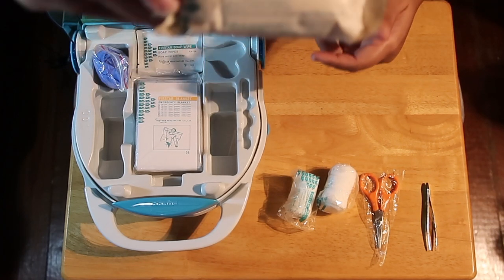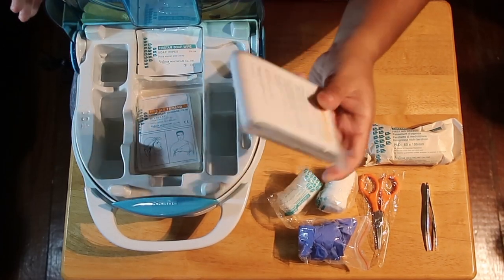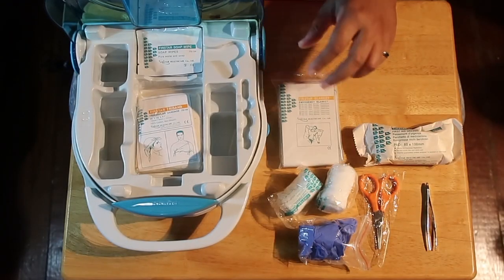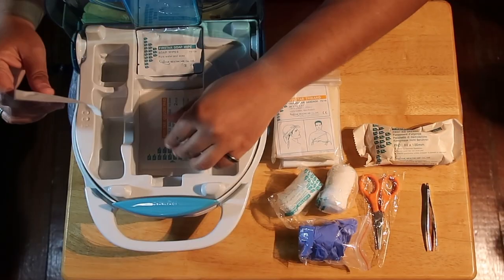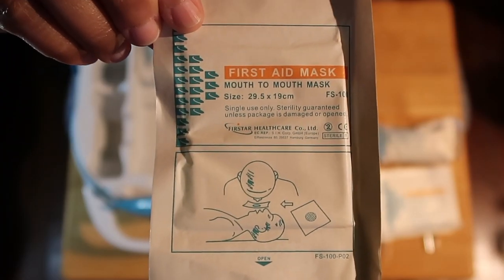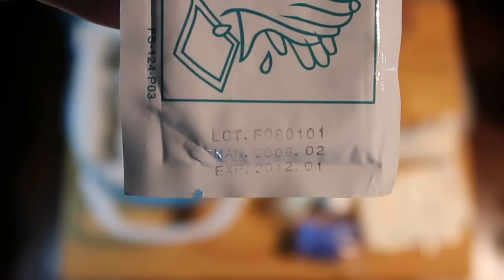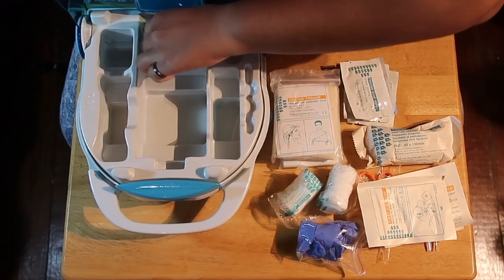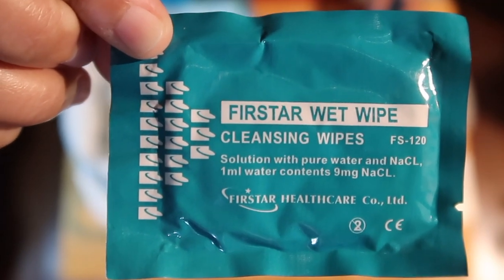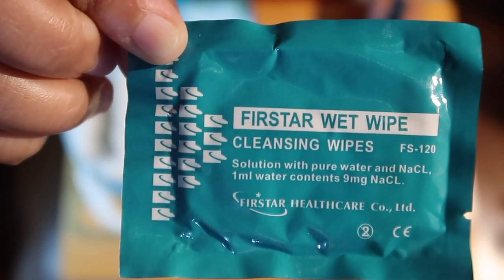First aid dressing pad, gloves, emergency blanket, triangular bandage, sterile gauze swab, 2, CPR barrier, expired, 3 soap wipes, also expired. Cleansing wipe, which really is sodium chloride and water in a wipe, also expired.